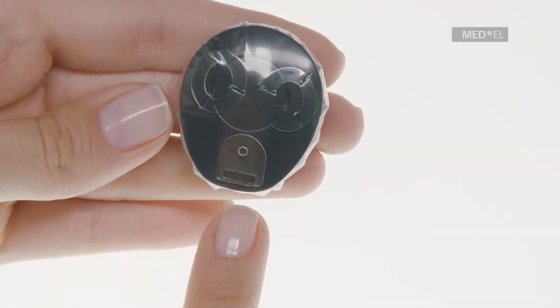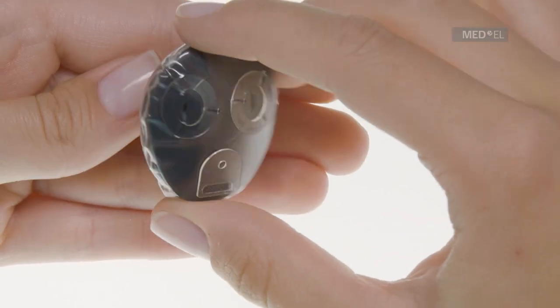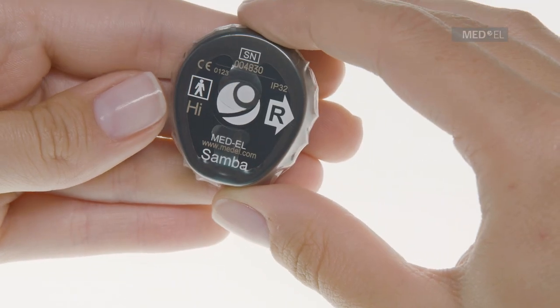Avoid pulling on the additional fixation option on top of Waterwear. You can easily recognize it by its fixation hole.